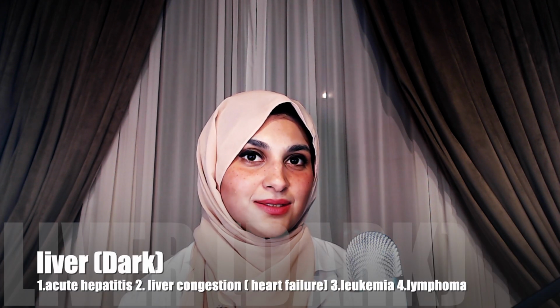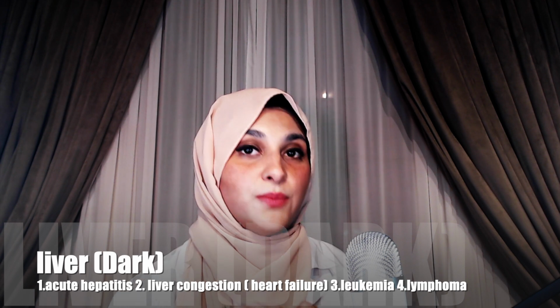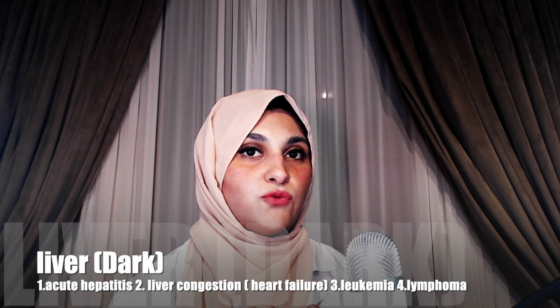On the other side, the four most common diseases in which the liver will look darker or hypoechoic are number one, acute hepatitis. Number two, liver congestion due to heart failure. Number three, leukemia. And number four, lymphoma.